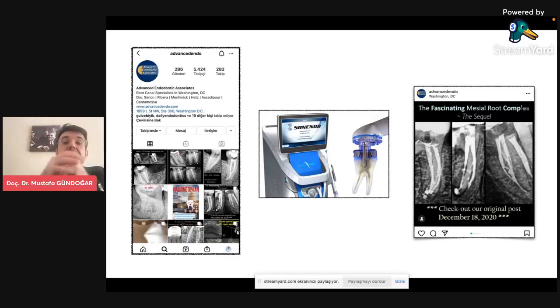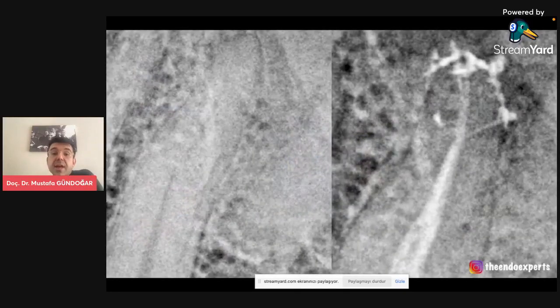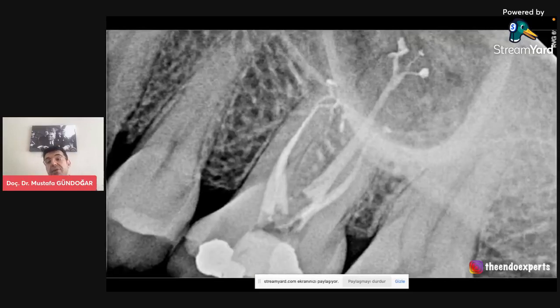Because as you know, preserving the pericervical dentin is one of our main goals while performing minimally invasive endodontics, because we don't want to risk vertical root fractures, so we preserve this pericervical dentin area. Now in these slides, you are seeing how GentleWave works, how it cleans all parts of root canals, and how you can obturate your root canals using bioceramic root canal sealers. This is literally the area of new endodontics, and we call it endodontics reimagined. I also name this technology in my country the new generation endodontics.